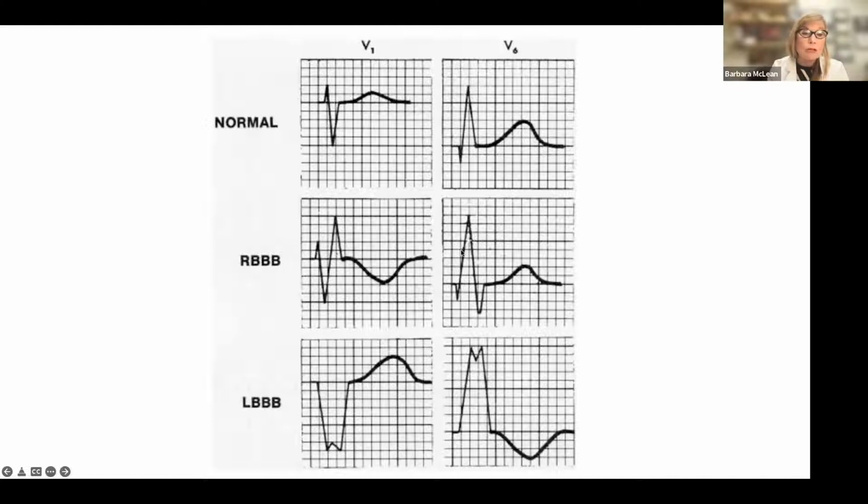And we see that inscribed on our left sided lead. We, of course, activate the left heart, but then current goes away from the left and back towards the right, inscribing that downward. And today our focus is left bundle branch block, and primarily complete left bundle branch block.